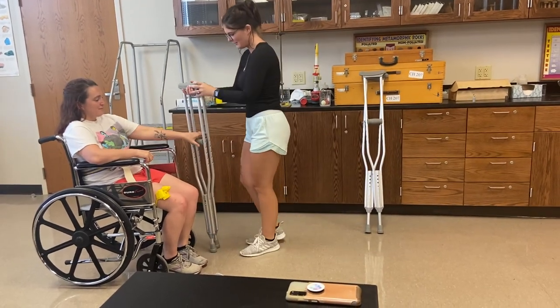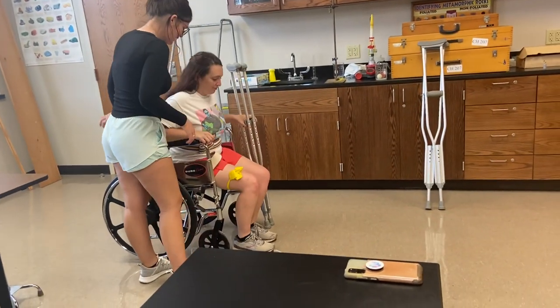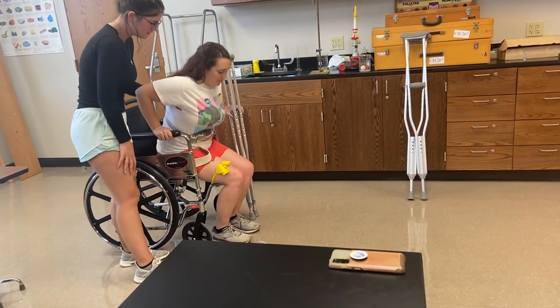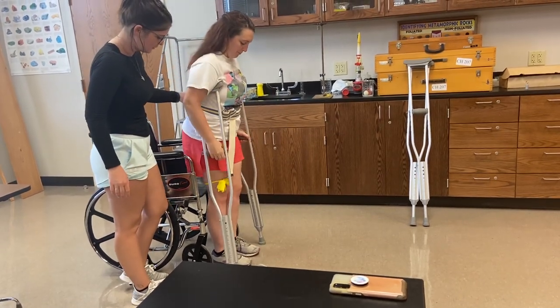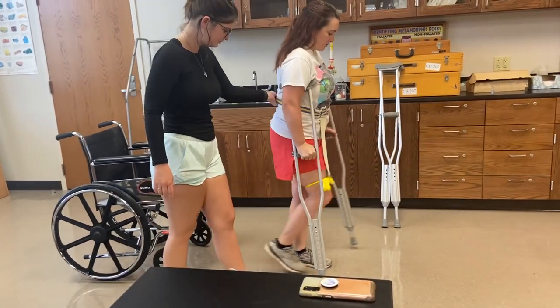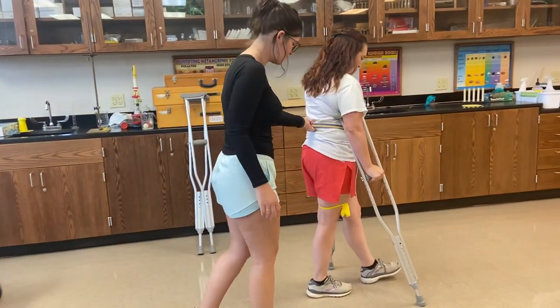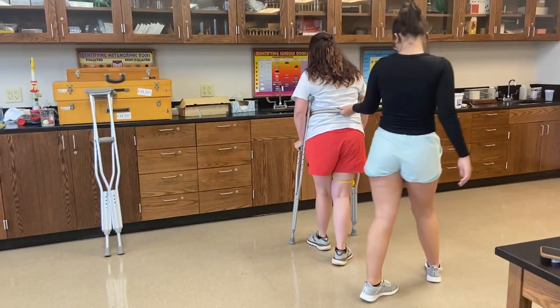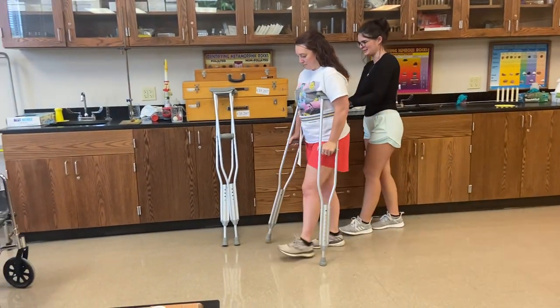Once again, I'll have you hold on that. Push your back into the back of the wheelchair, go forward, and hand right there — push up on the count of three. One, two, three. So it's going to go bad leg, good crutch, good leg, bad crutch. Then I'll have you start turning towards your good side. Good job.